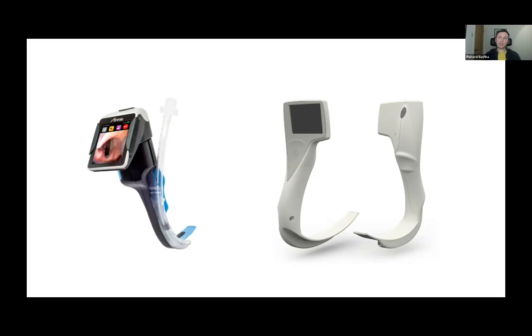On the right, we've got the iView, which again is a completely disposable device. It's a much more standard Macintosh geometry design. Again, because it's disposable, the optics aren't amazing when you compare it to the reusable devices. It only comes in one size, which is roughly similar to a Mac 4 blade, which does mean that it has reduced utility in your smaller patients. And they don't offer any hyperangulated options either. So personally, my feeling is that it doesn't offer much more than a standard Mac 4 laryngoscope.